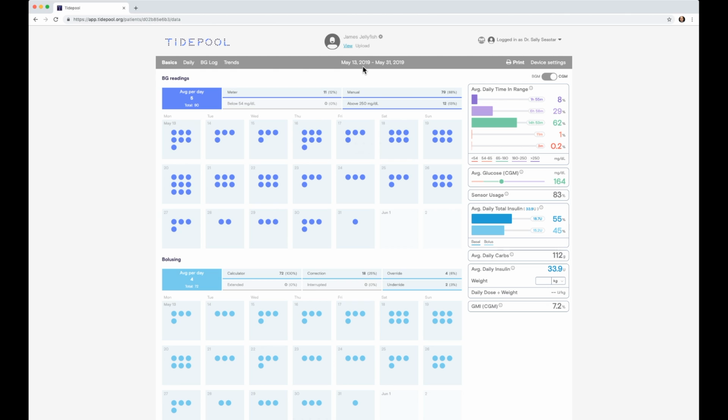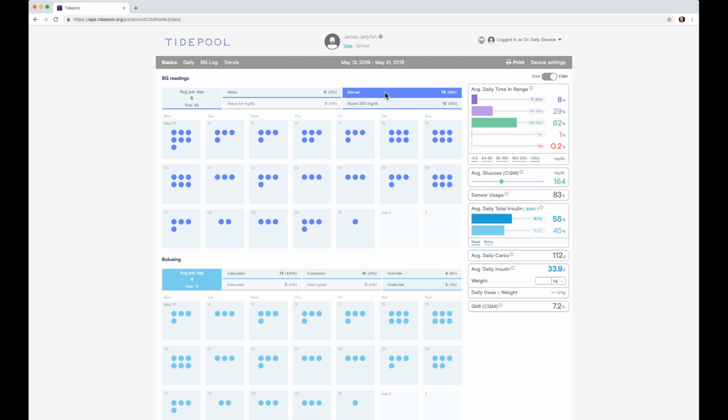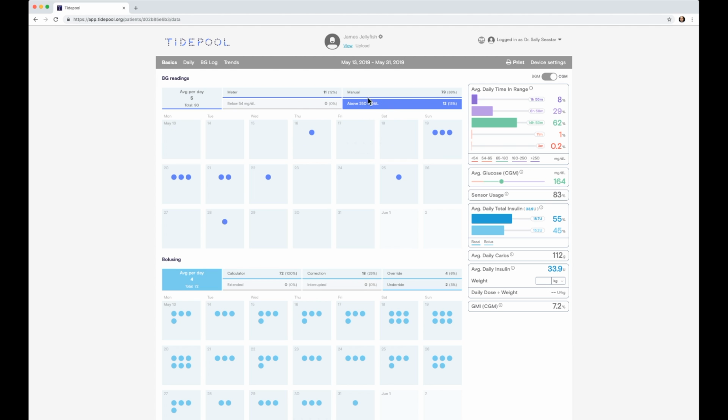Moving down the middle of the page, we first start with our blood glucose reading section. Here we have data that can either come from a blood glucose meter, and we can identify that by clicking on this filter first, or what Tidepool considers manual blood glucose readings, which means your patient has read their CGM data and entered that value directly or manually into their insulin pump for a bolus or a correction. Additionally, we can filter this section for readings that are below 54 or above 250, and use all of these different filters to identify trends and opportunities for data-based conversations with your patients.